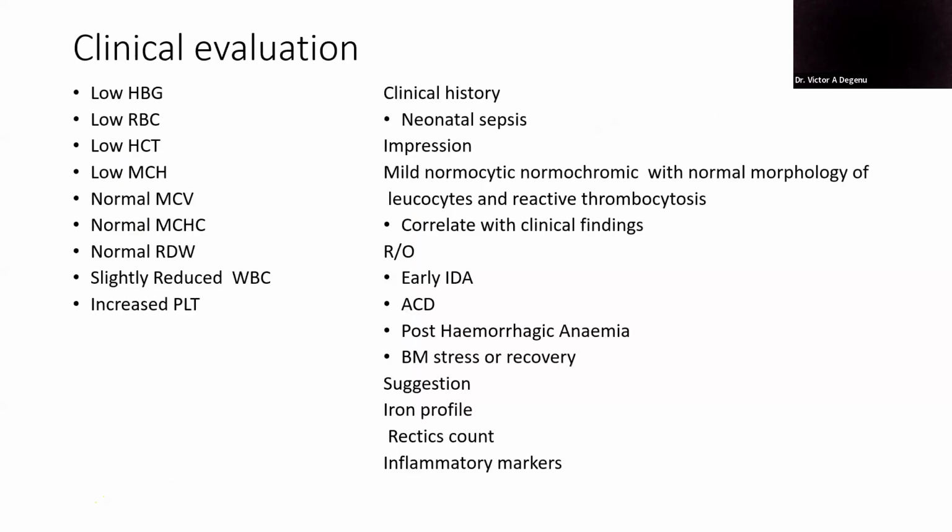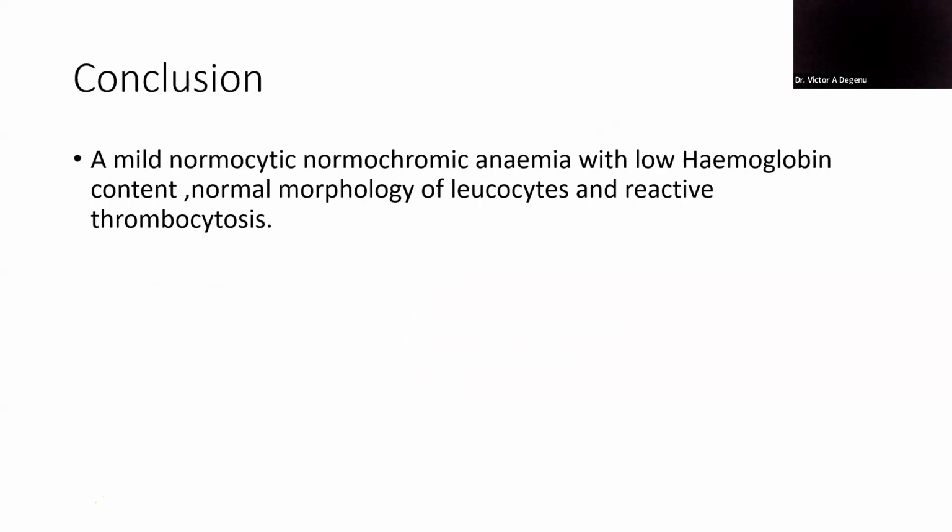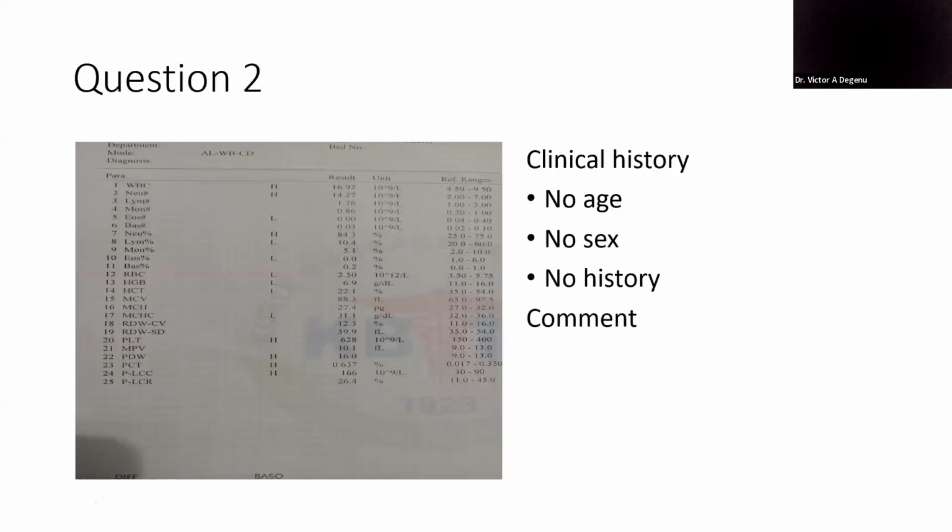And again, when you have all these full blood count reports before you, it is better for you to do your film. You stain your film and look at the various cell lines, that is RBC, your WBC, and your platelets. Then you can come out with conclusions as to what you are suspecting or what the suspicion is all about. And then you rule out a few things, so that your suspicion will be to the point or not to the point. So that was what we did.